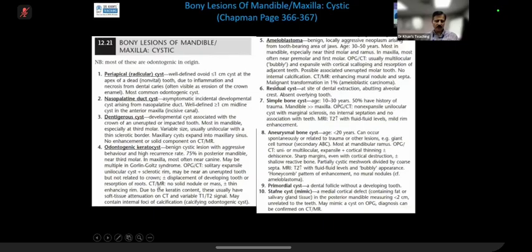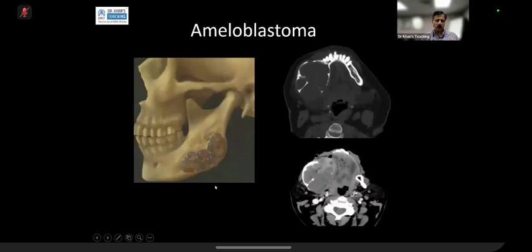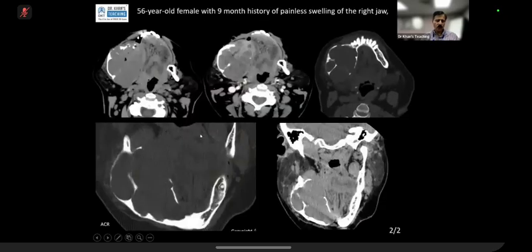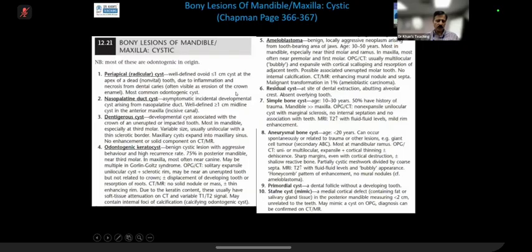You see this thing? No solid nodule or mass. So even if you want to consider it, then you rule it out. Because if the examiner says what else can it be, then you rule that out. So this is the differential diagnosis which you can see from here.